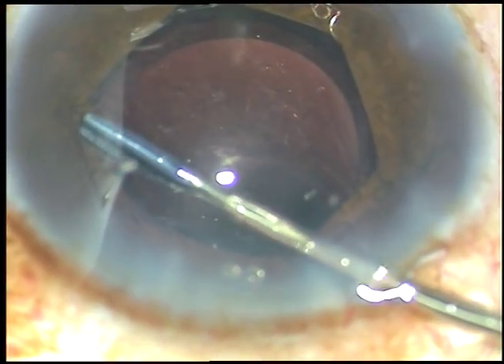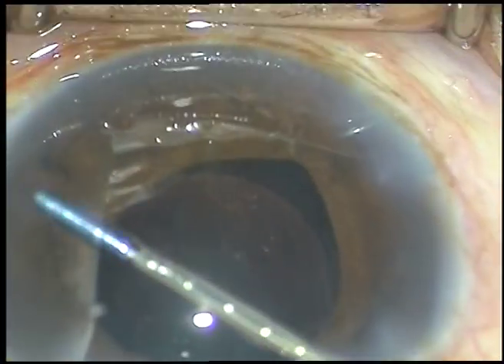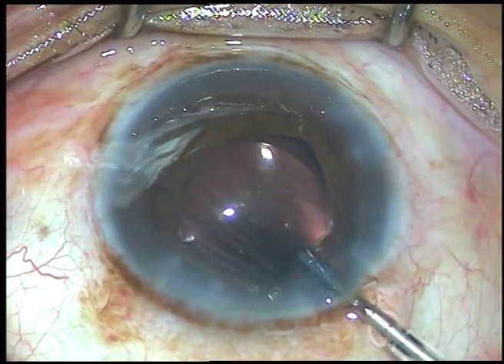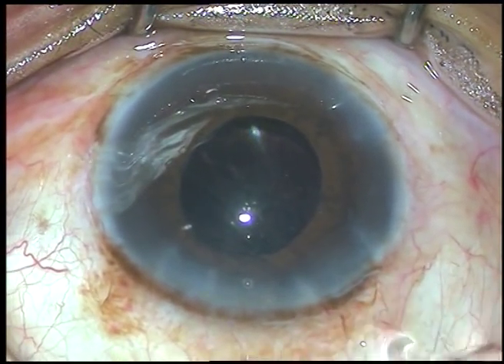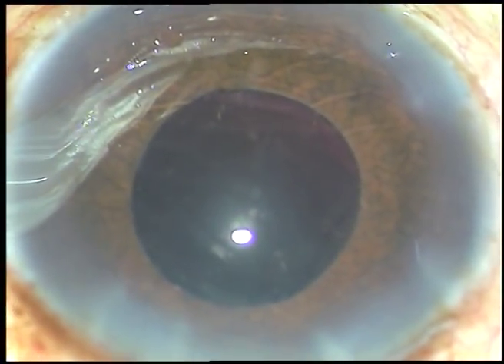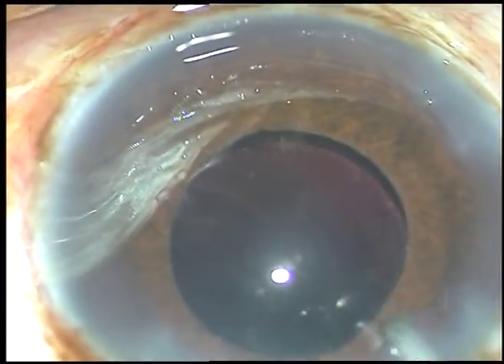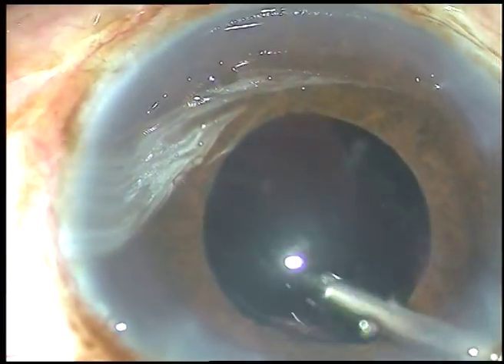Now this is how the Bhex pupil expansion device is being removed. The flanges are untucked and once the device is in the anterior chamber in front of the IOL, it is slowly removed through the main incision. So the Bhex pupil expansion device has simplified this case very much. Now see the pupil after removal of the ring — the pupil has taken a round shape. There is absolutely no damage to the sphincter pupillae.